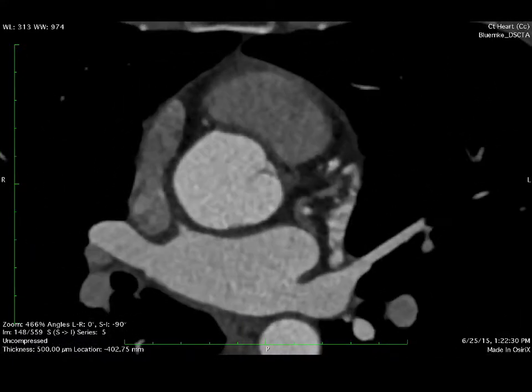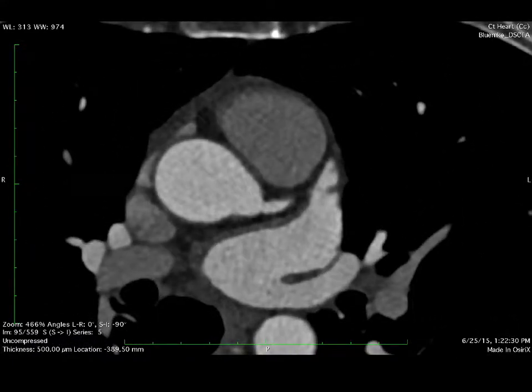If you go to these conferences where people who do this for a living get together, they have these games at the conference, and it's like Jeopardy. You ask a Jeopardy question, but to get to the question, they have to get the call right on a clinical case. And so they put up the case, and it looks exactly like this. It's an axial plane. And the clinician has to page through the case.